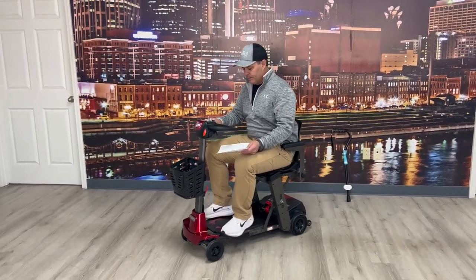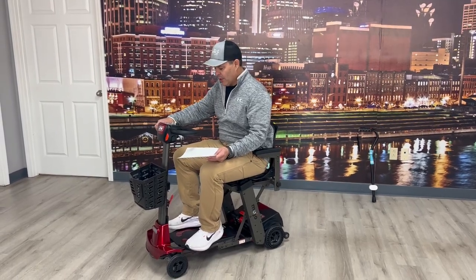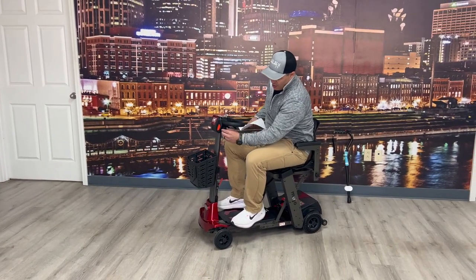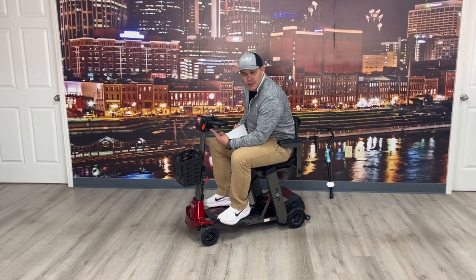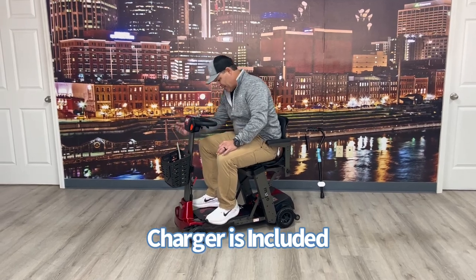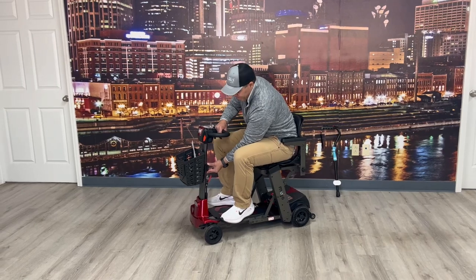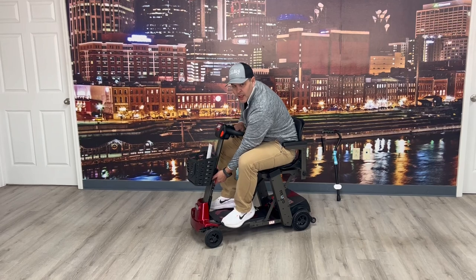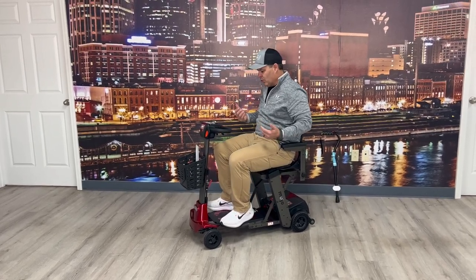It's got electromagnetic brakes — when I'm sitting here and I pull the trigger it will stop on its own, that's what electromagnetic brakes are. It's got your reverse, your round tiller for easy control. It also has a place where you can charge the unit, so it does come with a charger. Another feature I like is the adjustable height tiller — you can raise it up and down and also bring it forward and backwards, so you have both those benefits.